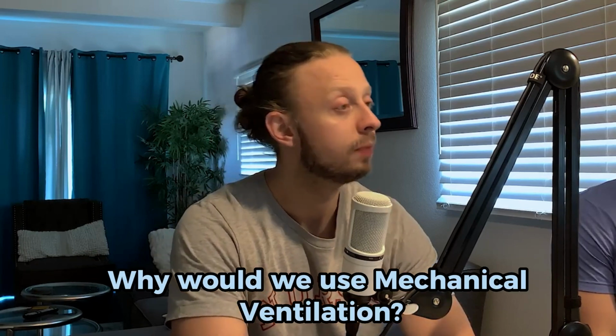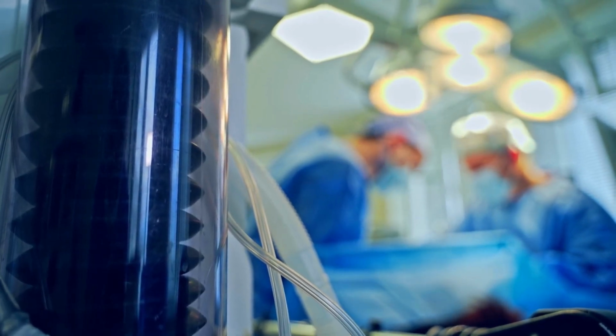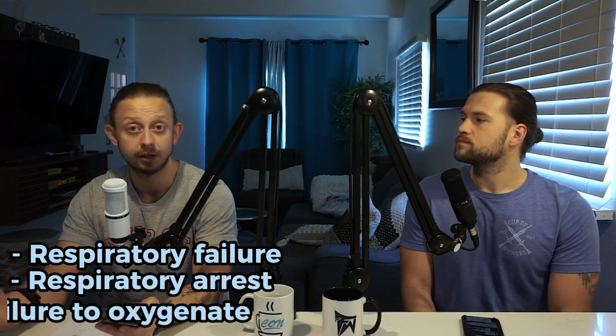So why would we use mechanical ventilation? The majority of the time, you're going to see somebody on a mechanical ventilator post-op. If we're prepping somebody for surgery, and it's an extensive surgery, we're going to have to mechanically vent them. Some other issues that might require mechanical ventilation are respiratory failure, respiratory arrest, and failure to oxygenate.